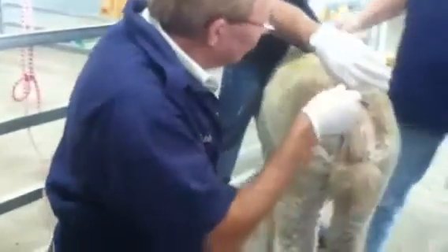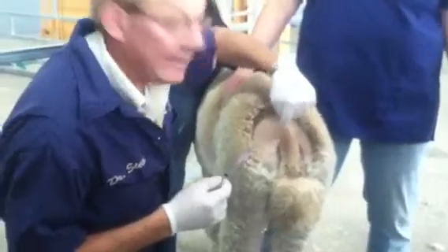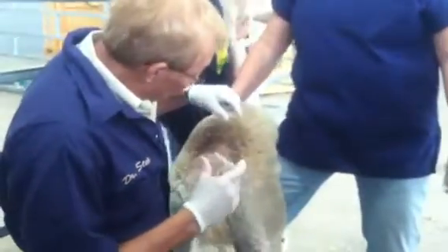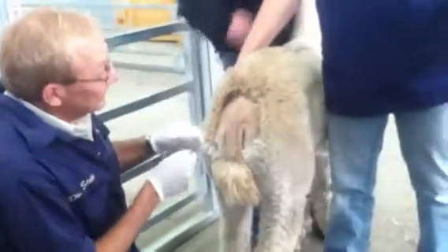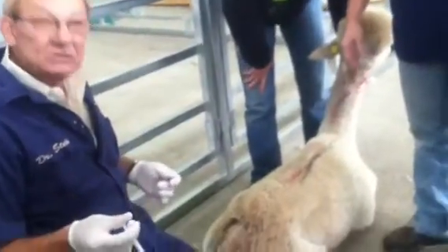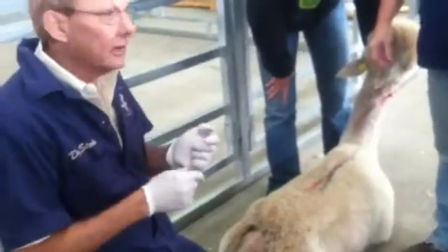What I would do in a case like this in real life is I would inject lidocaine. Pretend this is lidocaine — you know what lidocaine is? It's a topical anesthetic. What I would do is take this and stick it all around here, make a bleb, stick it all around there, and then give her a couple minutes to let it take effect. I don't want her to feel the needle going into the skin.